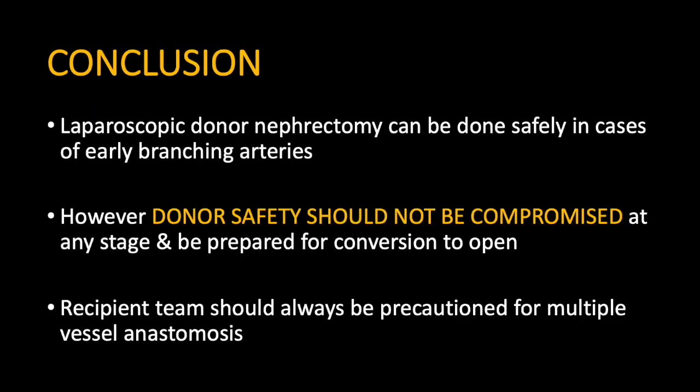To conclude, laparoscopic donor nephrectomy can be done safely in cases of early branching arteries. However, donor safety should not be compromised at any stage and one should be prepared for conversion to open. The recipient team should always be cautioned about the possibility of multiple vessel anastomosis.